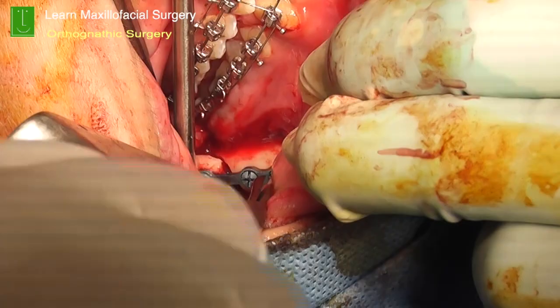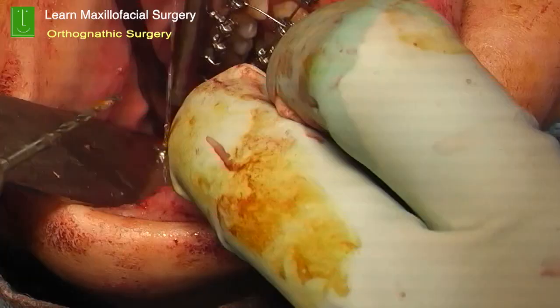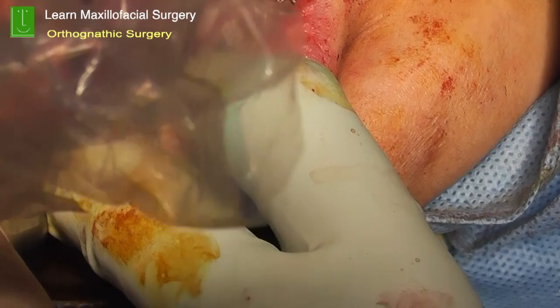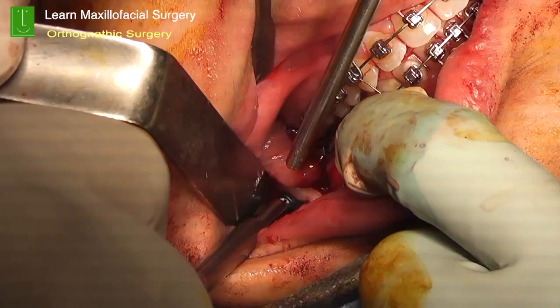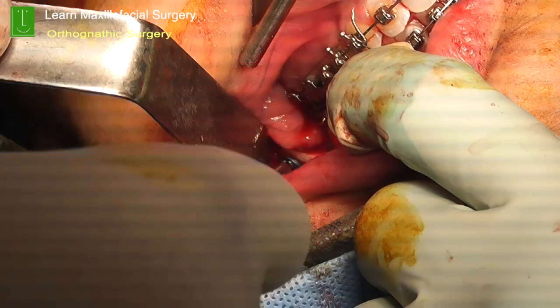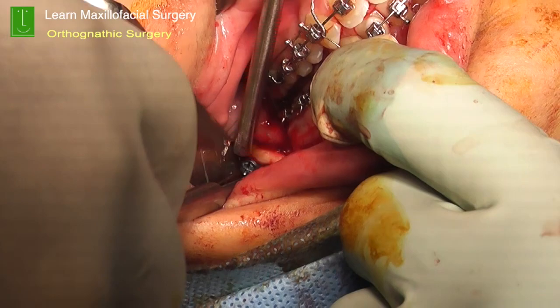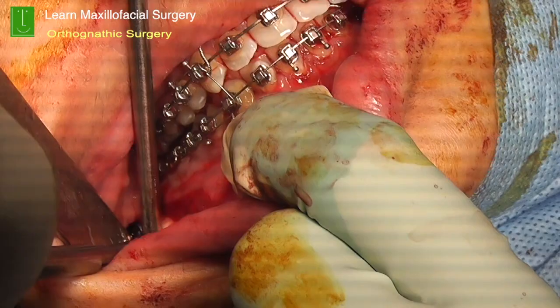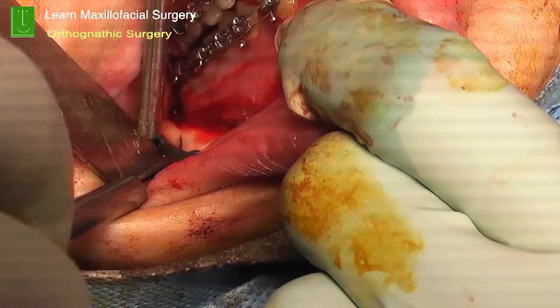The question sometimes is whether we need to use a locking plate. It's your personal choice. I use a simple conventional mini plate that has worked in my hands very well. A locking plate probably gives slightly better stability and less chance of the screw getting loose. So that is something which you can definitely consider when you're fixing the mandible. One plate is good enough. You don't need two plates on either side. So it's basically one plate on either side, and that gives good enough rigidity to hold the fragments rock solid in position.